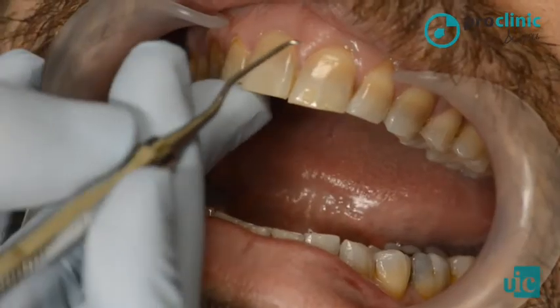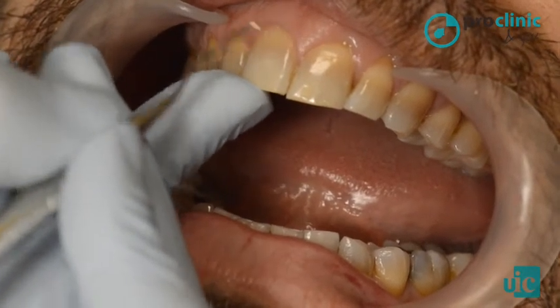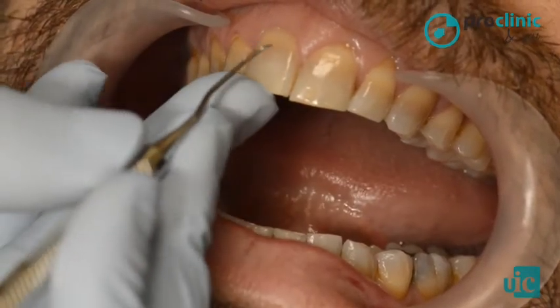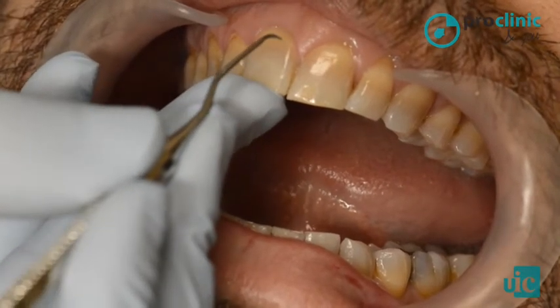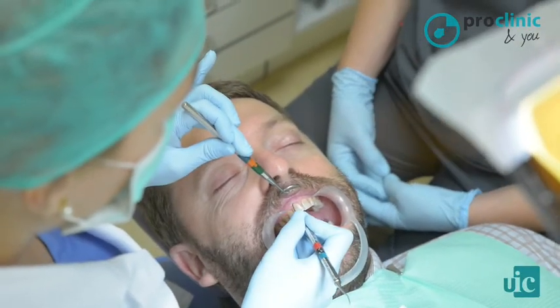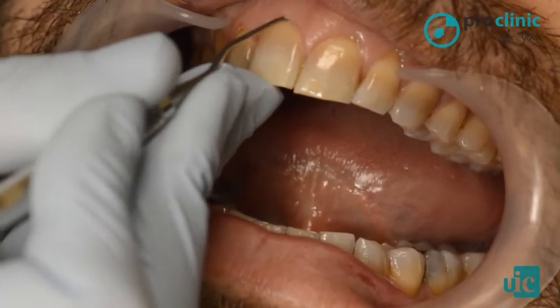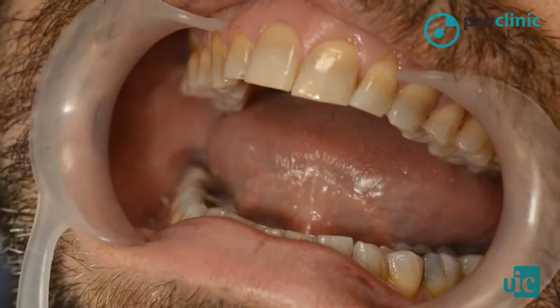At the level of the incisors, the closer we are to the work area, the greater control of the instrument we have. The teeth that we are going to scrape will be those that have a probing depth of 4 or higher. Scaling and root planing due to the pain should always be done under local anesthesia.